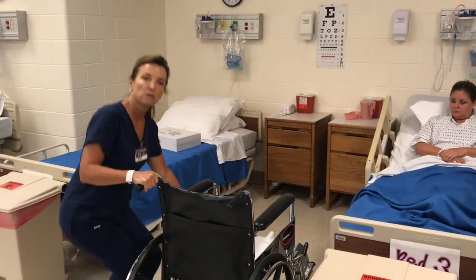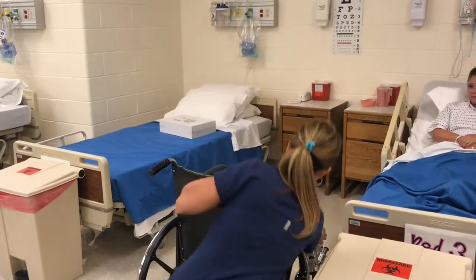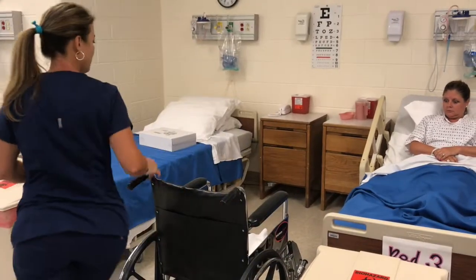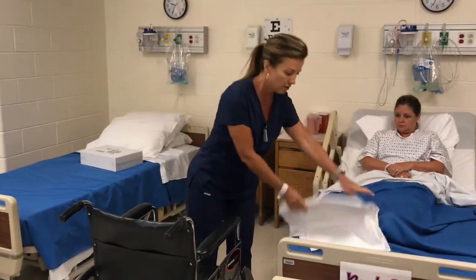You want to make sure you lock the wheels using good body mechanics — that means don't bend at your waist. Make sure the footrests are both up. And they are.